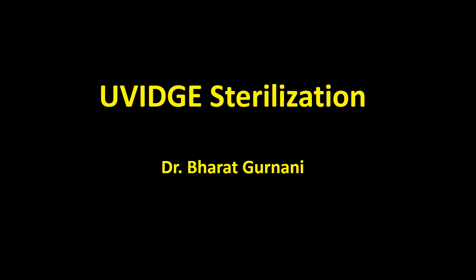In this video, we will show how respirators are sterilized using ultraviolet rays and hydrogen peroxide spray. This process is named as UV sterilization.